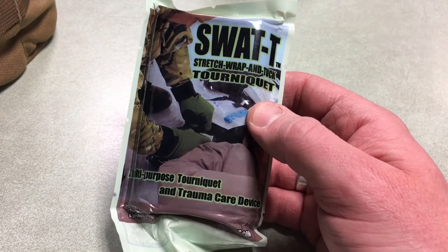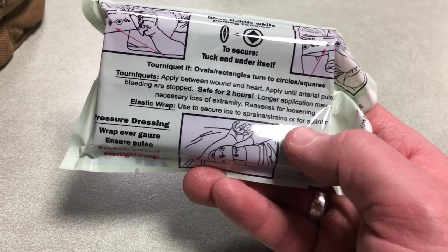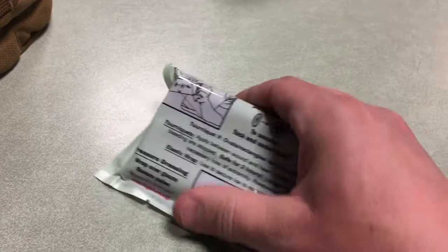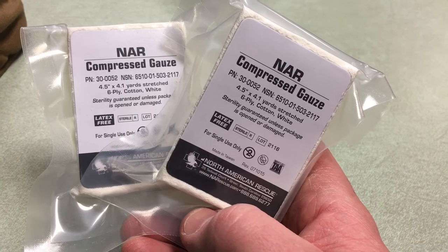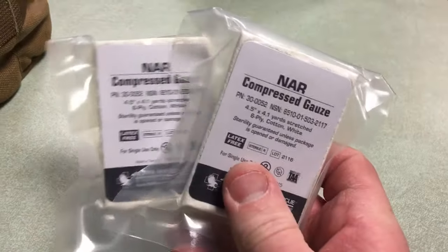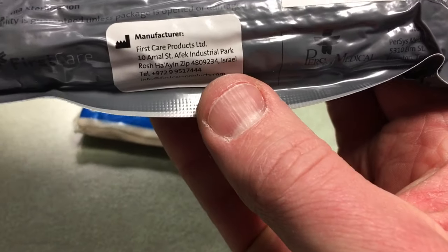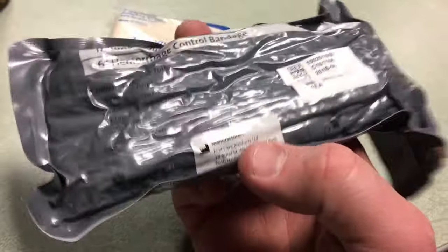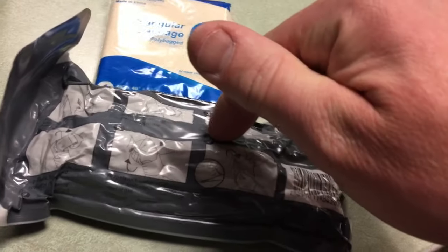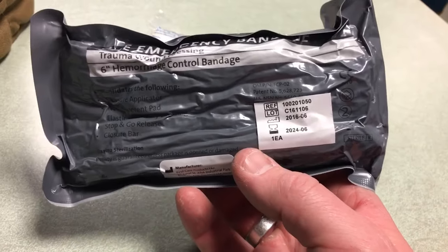Here's the first of three items in that little back section — the SWAT-T tourniquet. You can use it as a tourniquet, an elastic wrap for sprains and strains, or a pressure dressing wrapped over gauze. Next we have compressed gauze: 4.5 inches by 4.1 yards, six-ply cotton — it feels like a small brick but expands into something much bigger. Last in the back section is a triangular bandage and an emergency bandage — also known as an Israeli bandage, made in Israel, sealed with an expiration date. I actually opened and tested one of these in another video.